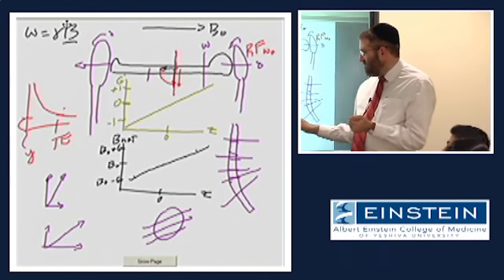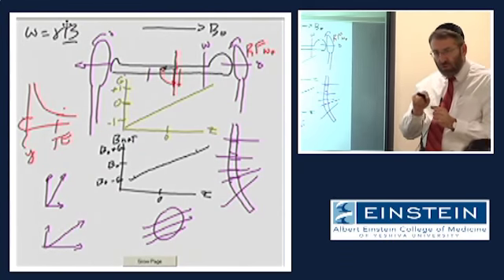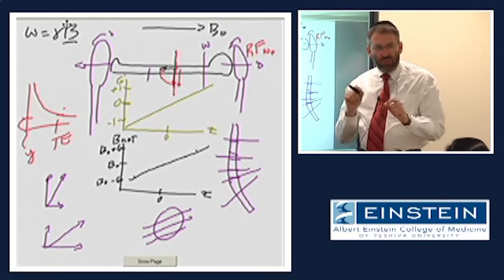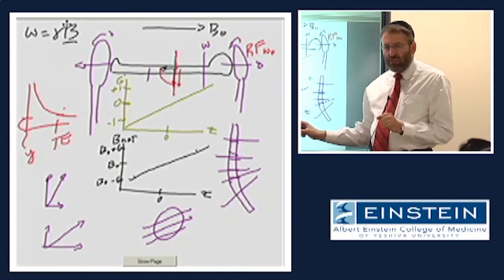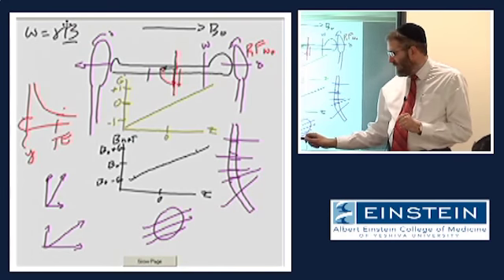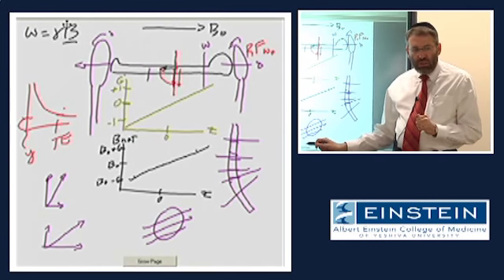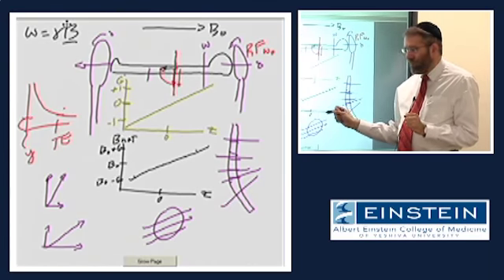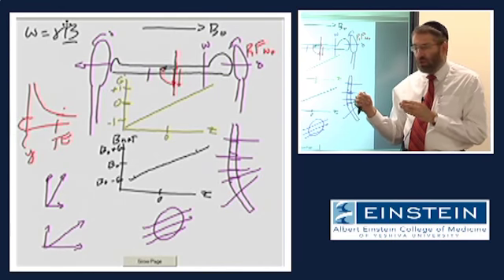So you as the user don't actually have to specify things like turn on these 1, 2, or 3 gradient magnetic fields at these specific strengths. Those computations are all done for you automatically. But that is what's going on when you position these slices. And there can be limitations in terms of how steep an oblique angle, for example, you can generate.